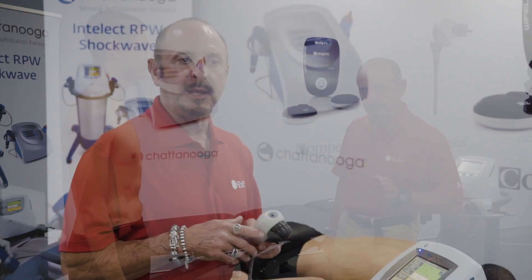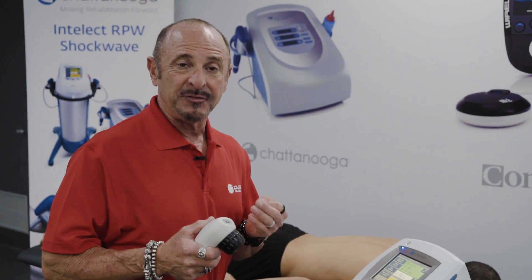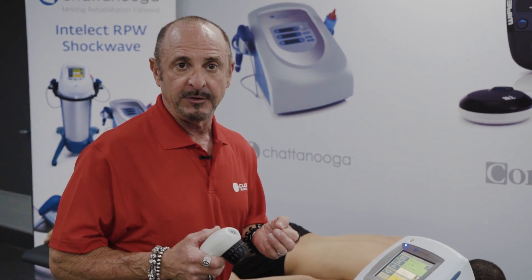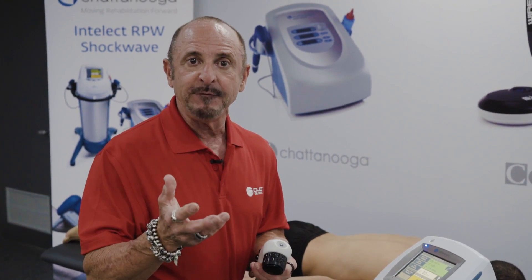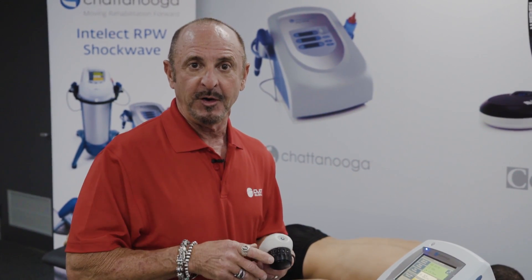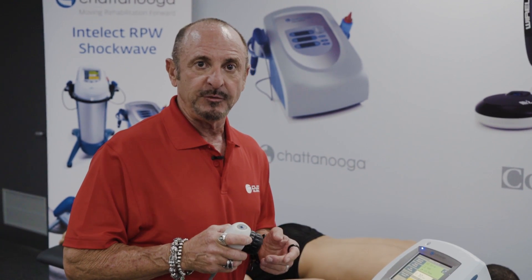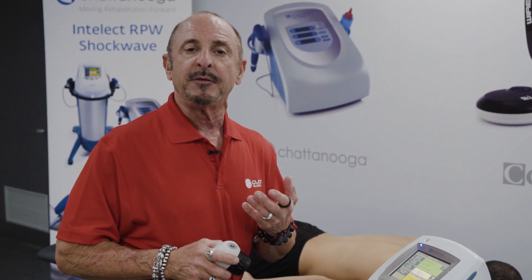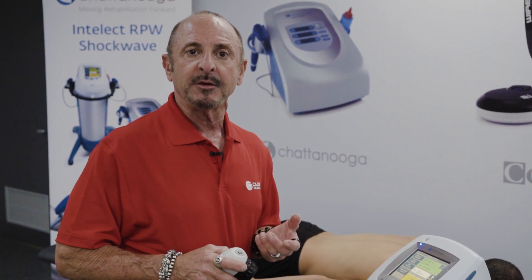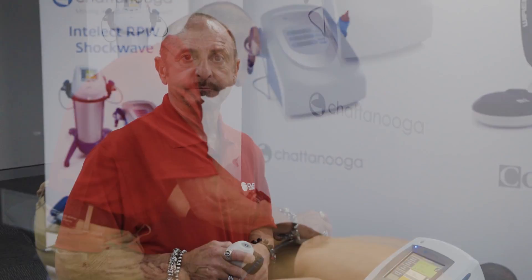To begin our treatment, we're going to select our vibratory actor. Especially in the spine, this is what's really going to save your wrists and elbows as a clinician, because this is going to do the deep tissue release right away for you and provide a very relaxing desensitization massage. We apply it at one thousand to fifteen hundred shocks.